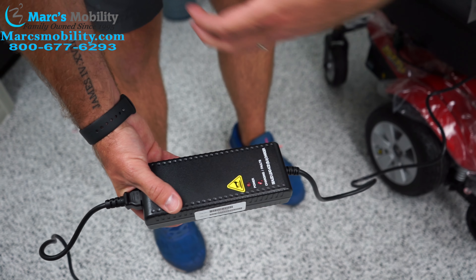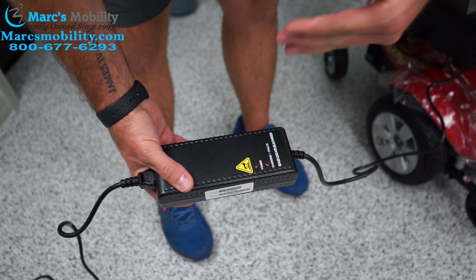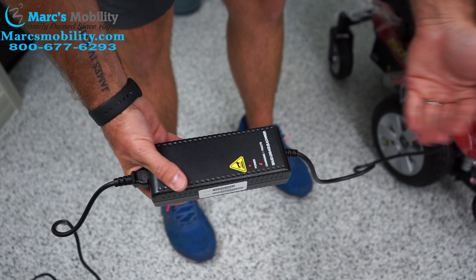Once it is plugged into the outlet you're going to see two lights come on. Your power light is going to come on — that's showing red — and your charging light is also going to be red.